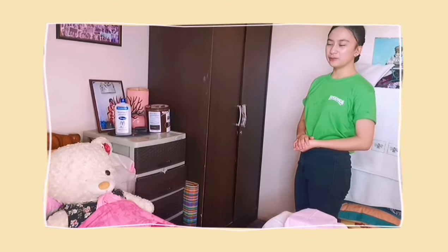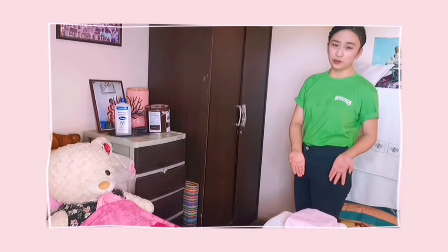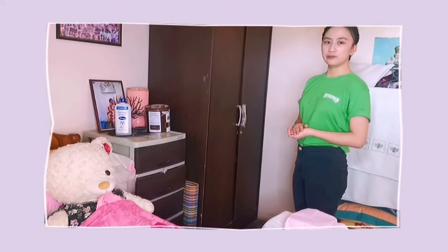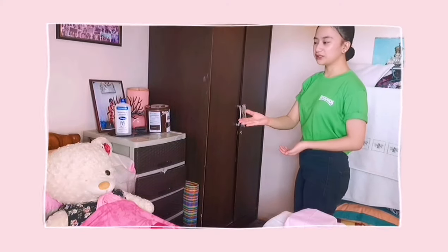My name is Roxanne Gale Canora and I will be performing my term demonstration on Foley catheterization. First is assembling the equipment, which is the Foley catheter kit. Then before touching the patient, I will be doing hand hygiene, providing privacy, and then verification of the patient.